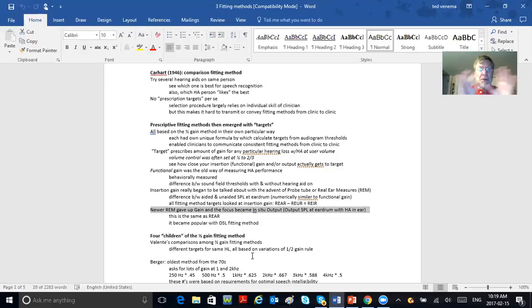So the whole purpose of this is just to give you history, context, so that we know where we are today and why, what happened. So real ear today really only cares about real ear aided response. What's my aided response? We don't really care about unaided response anymore. We measure the guy's hearing loss under headphones.